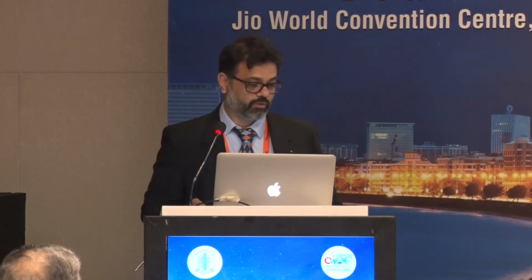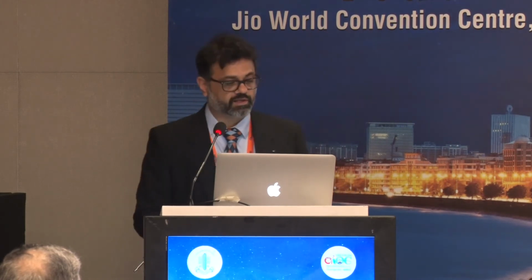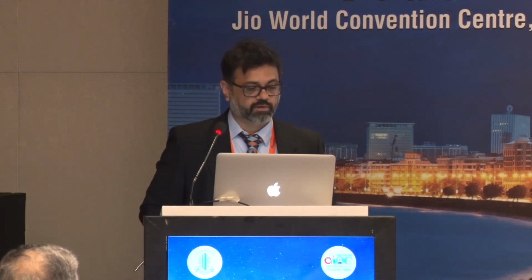This is one of my fellows who's doing it, and I thought, okay, no, let me take over, and this is what I have done, not the fellow. I have a rent out there, and I don't know how big. So I use a dispersive viscoelastic without shutting off the irrigation, and now assess the situation. My CCC is intact, that's for sure.